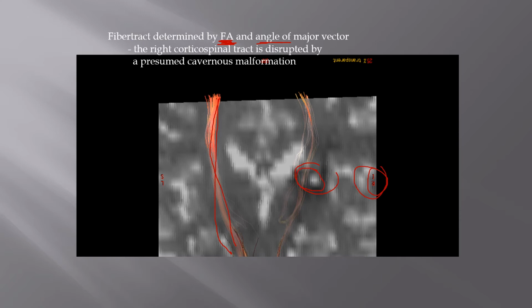Some of you might recognize it. It has this T2 B0 recon image. It has a dark outline and a bright center. The patient was having weakness in their left hand, and the tracts, we're hoping to see that they were displaced by the lesion, but the white matter tracts were running through the lesion, and you can see that that corticospinal tract on the right side is attenuated versus on the left side.